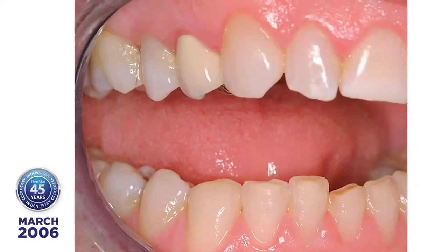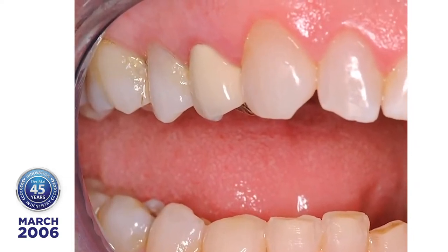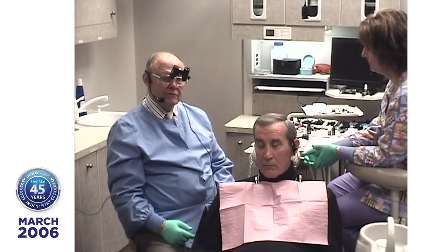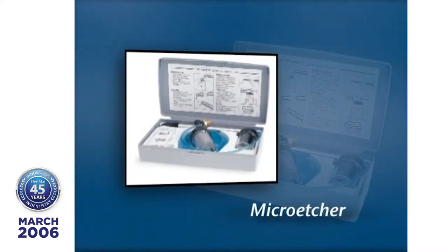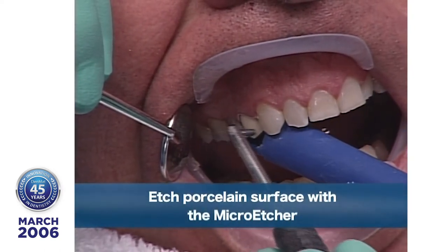And one of the things that will be interesting today is the doctor's upper right first bicuspid is a porcelain crown. So we're going to do surface treatment for a porcelain crown on the upper right first bicuspid and bond to that, and then we're going to bond to these lowers at the same time. So I'm going to take a micro etcher and etch the surface, or micro etch the surface, micro abrade it.